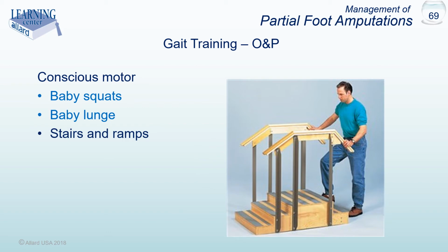Patient safety is always one of the primary concerns in modifying how a person walks. Train patients how to navigate up and down stairways and ramps using standard prosthetic protocols of leading with the sound side to go up and with the involved side to go down.